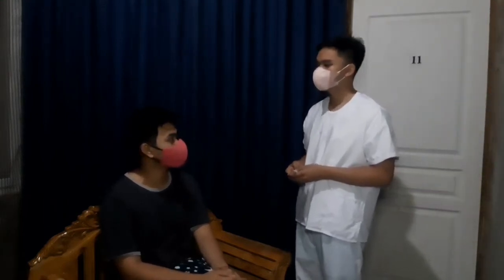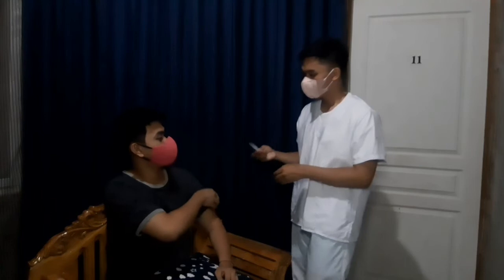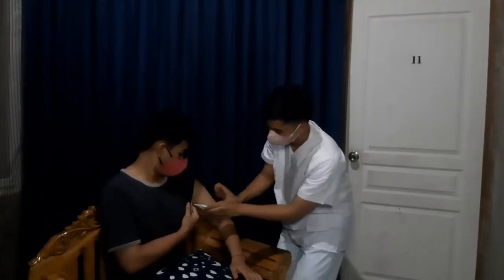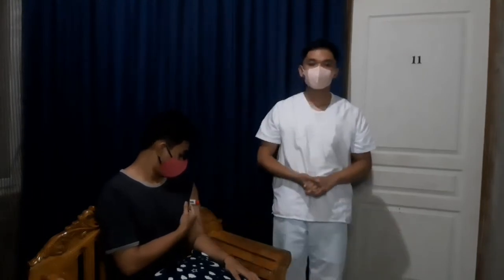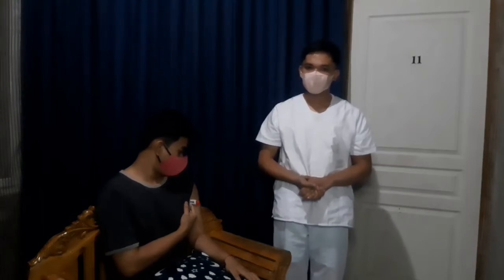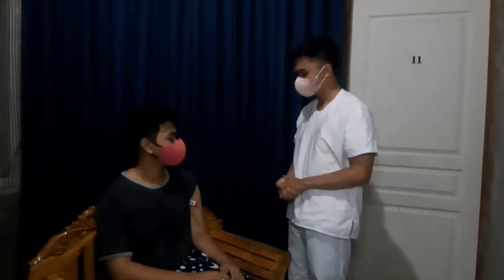Greet the client and state that you will start the procedure. First, place the thermometer at the appropriate route and site. Wait the appropriate amount of time. Electronic and tympanic thermometers will indicate that the reading is complete through a light or tone. Once you hear the beep of the thermometer, you can now remove it and check the temperature.